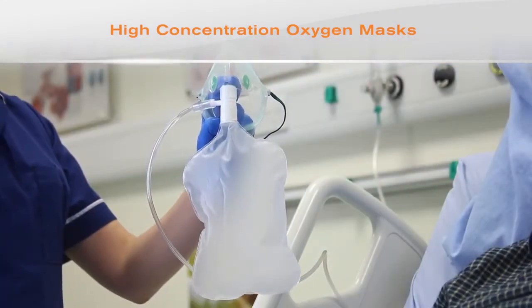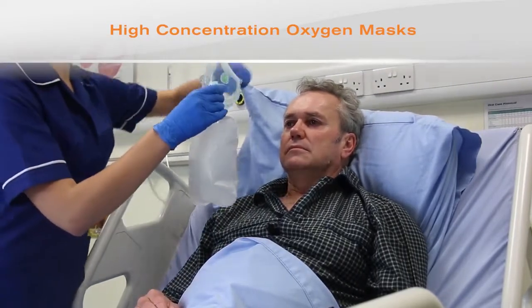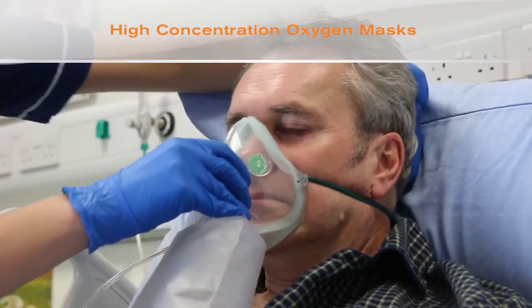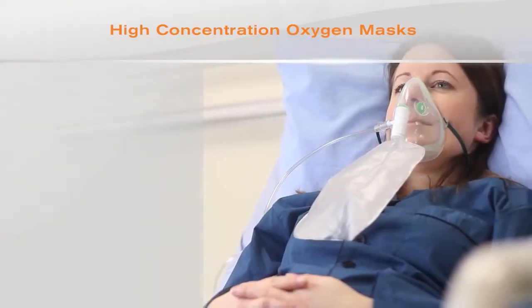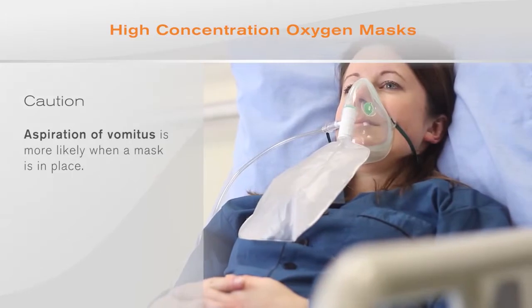Refill the reservoir bag and place the mask on the patient's face, obtaining a tight but comfortable fit. Adjust the oxygen flow rate so that the bag deflates by no more than 1/3 at the end of inspiration. When a mask is in place, be aware that aspiration of vomitus is more likely.